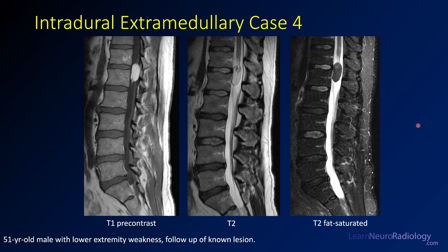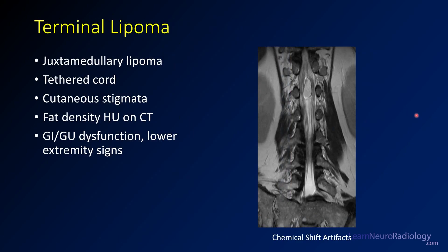Case four: a 51-year-old man with lower extremity weakness and a history of a known lesion. On pre-contrast T1, there is a T1-bright lesion. On T2 it's approximately isointense to CSF, with a subtle rim of darkness around it. On fat-saturated imaging, there is near-complete suppression of signal within the lesion — confirming this is a fat-containing lesion. That rim of darkness is the chemical shift artifact. A fat-containing lesion along the conus can be a lipoma, dermoid, or teratoma. This one is a lipoma; they can be associated with tethered cords and cutaneous stigmata.